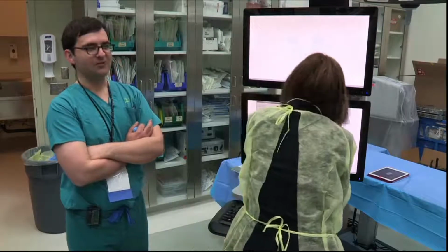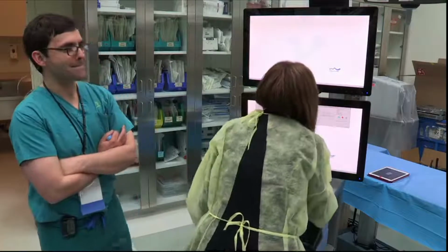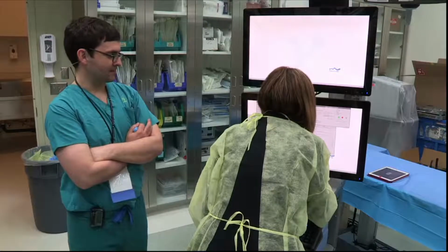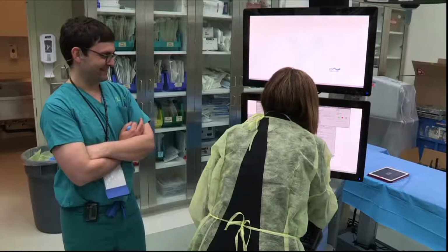Does anybody have any questions? No. Okay. They can edit this out. It's not really an MRI.